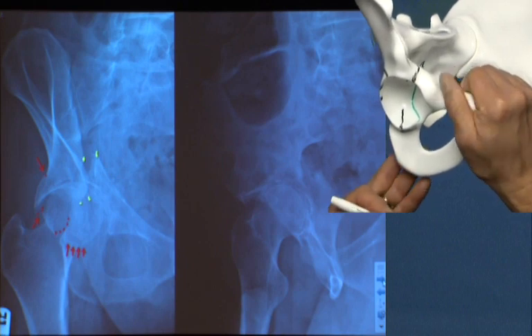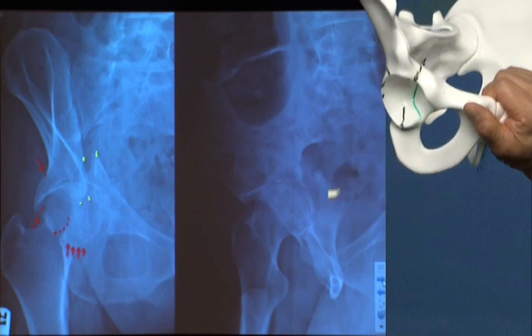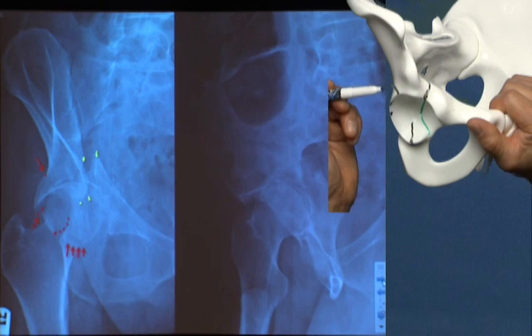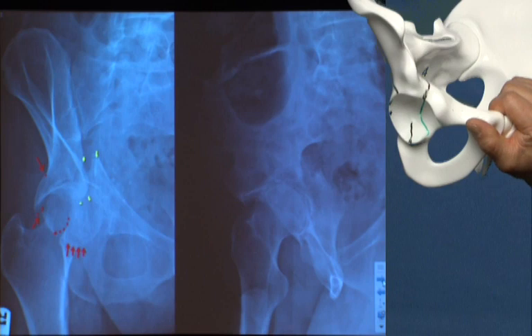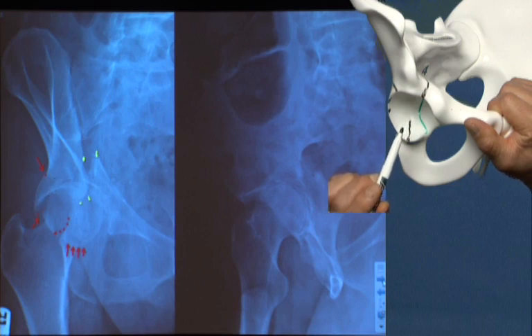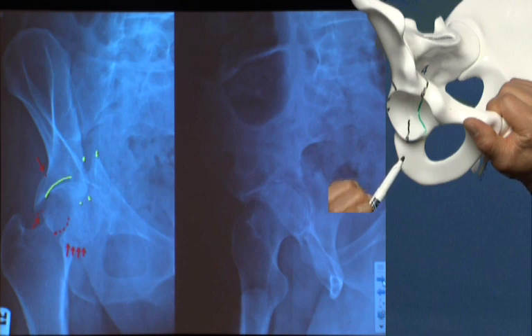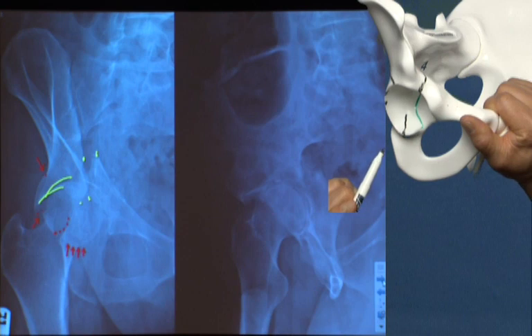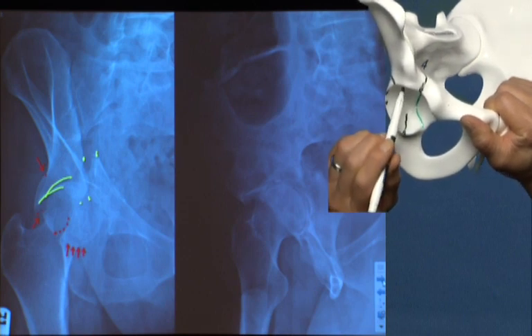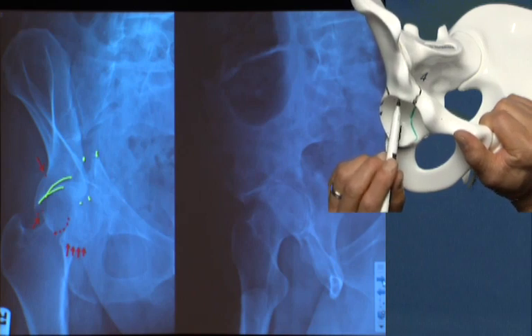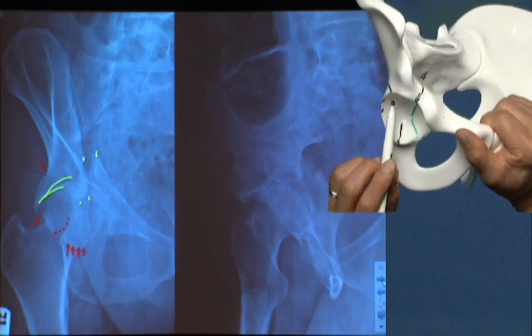Other information from the obturator oblique includes the status of the obturator foramen, where again we don't see an obvious displaced fracture, and I do not see any other fractures extending up the iliac wing aside from this small vertical fracture line we've just picked up. When I look to the radiographic roof shadow of the obturator oblique, I can clearly see two arcs of the roof of the acetabulum laterally — one which the femoral head is following, and one which the femoral head has dislocated away from. Because of the displacement, the femoral head is following probably an impaction or separate articular fragment, while the intact roof is being left superior-laterally.